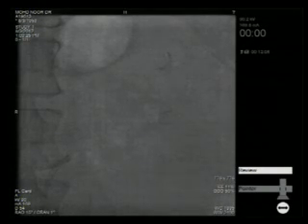Aspirate, flush and engage. You can go to the other side. Dr. Narasimhan, we are told the second lab is ready for the next live case, and we will leave you at this stage. Sure, thank you. We will listen to your results later. Thank you very much.